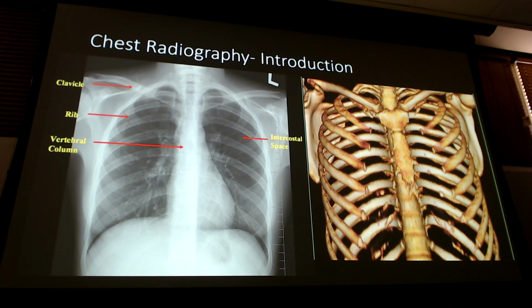When we pick up the CT and they do it, they say, hey, do a 3D model of just the bone. You can tell the machine to do that, and it leaves the cartilage out. So that's going to show the different ribs and why the cartilage does what it does. And look at these posterior guys. All of them go directly into the vertebrae. The anteriors kind of come down and stop. See how it stops mid-chest right there? See how that rib kind of stops? It's because of the cartilage.